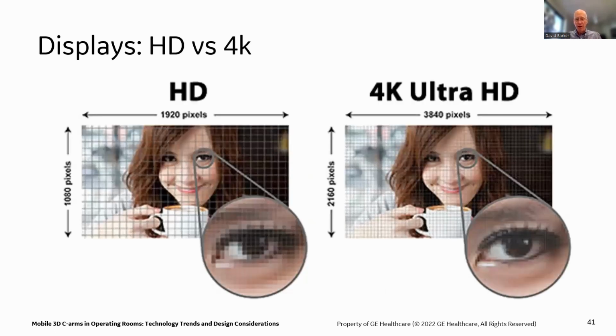The other thing that's ironic is people will talk about the wonderful resolution they have on their detector. They'll talk about all the wonderful things they're doing with their processing and how well they're calculating everything. And then they send it to a really low resolution monitor, which is doing the same thing as binning again. They're taking all this wonderful calculation and saying, well, I'm not going to show you all my calculations. I'm going to bin my calculations and send it to a really dumb display and throw away all this great calculation. So I'm showing you fat pixels at the end of the problem instead of gathering fat pixels at the beginning of the problem.